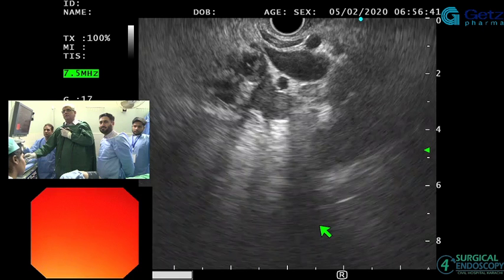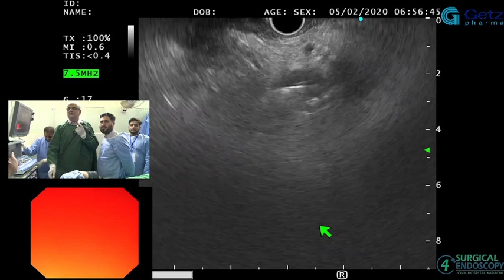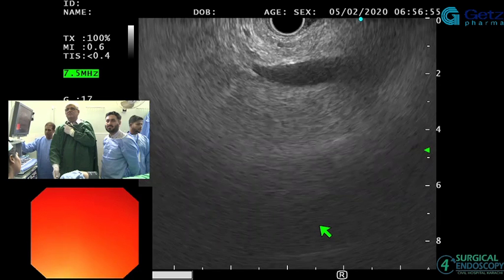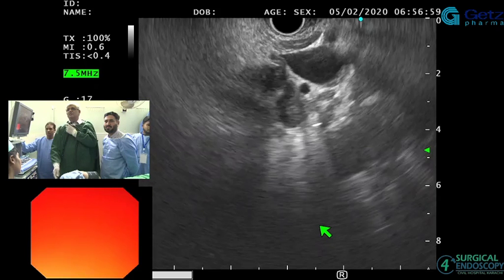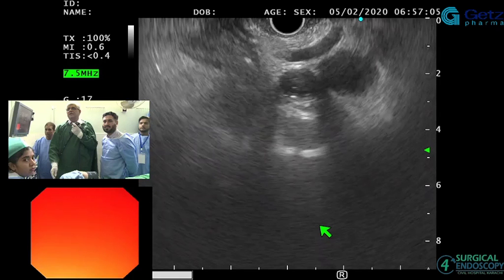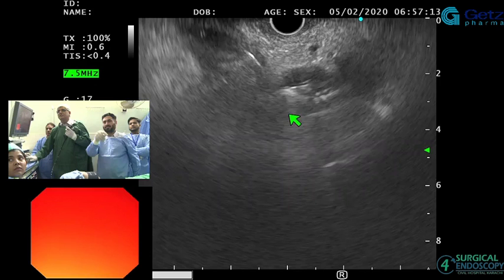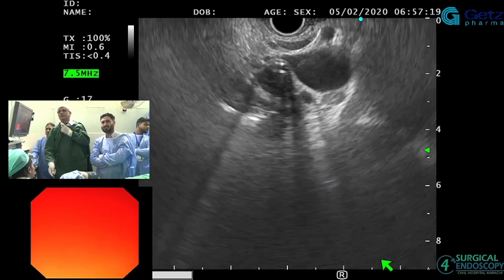Okay, what area is it? This is pancreatic here. This is your portal vein, right? This is the portal confluence. That's your stent. Can you see the stent there? CBD there. There's the stent. You can see the CBD here. Can you appreciate the CBD? Yes. So you can see the CBD there, and hopefully see the stent there. It's dilated now. You can see the stent better.